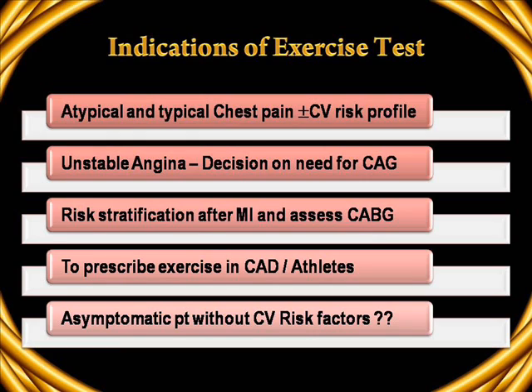Of course, in some individuals, healthy individuals or coronary artery disease patients or athletes, in order to prescribe the level of exercise when they go home after discharge from the hospital or when they go for work, what should be the level of exercise? In order to decide that, we may require exercise testing. Is it necessary to do a treadmill test in everyone around, say, 30 or 40 years like that?